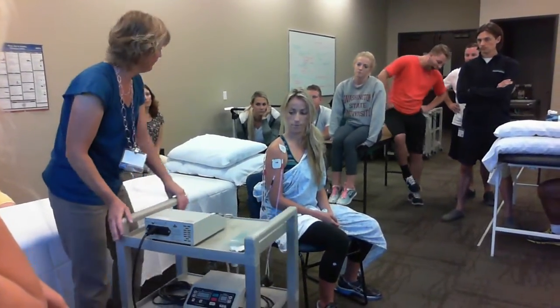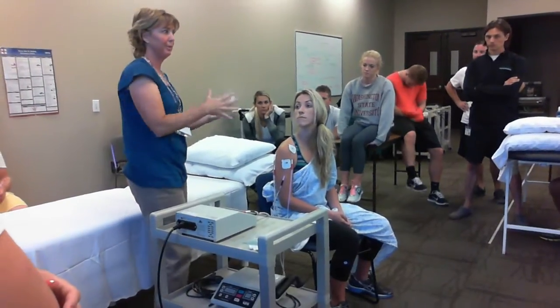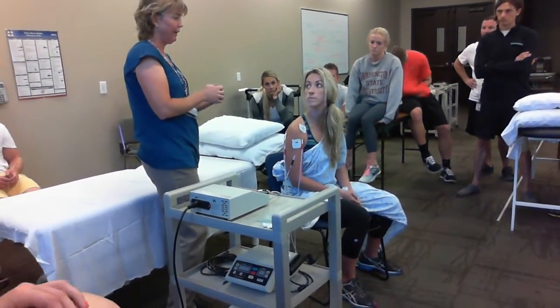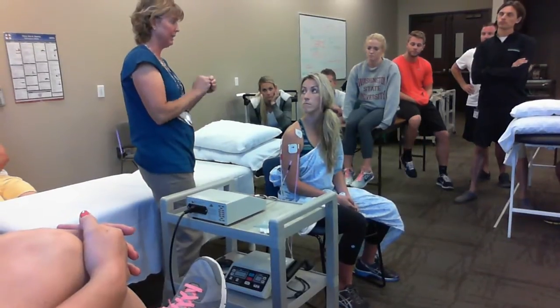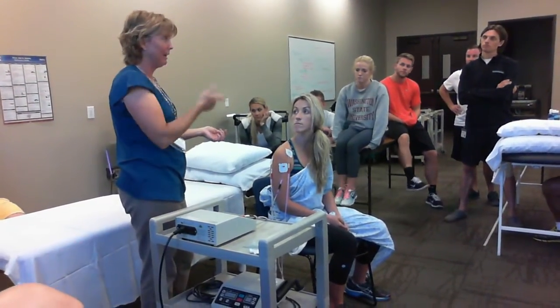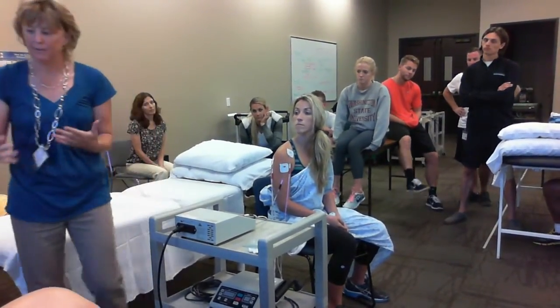Now, as far as putting a cold pack on first. Some people like to put the cold pack on first and then start the current running. That's fine as long as you and your patient understand that there's no pulsing that I want with this treatment. It's a tingling sensation only. So if it is pulsing, I might not be able to see that if it's covered with a cold pack. So you just have to weigh that out.